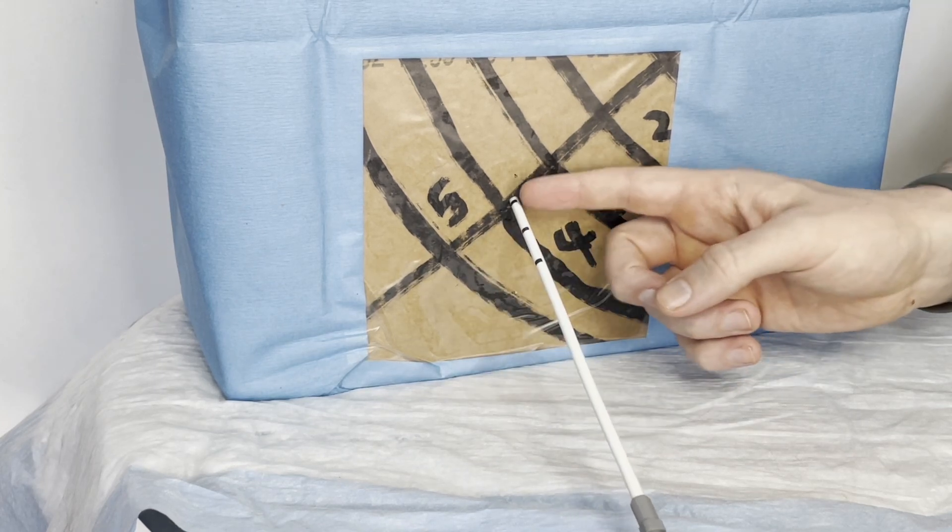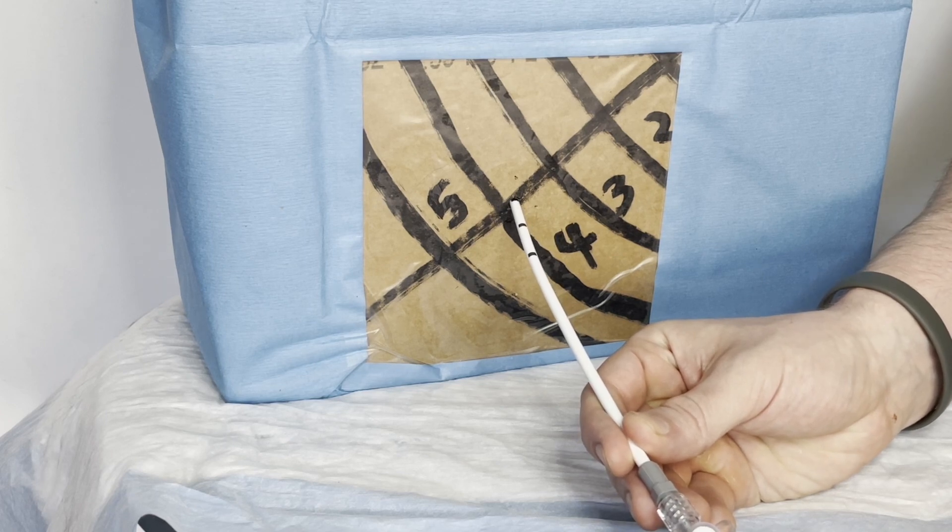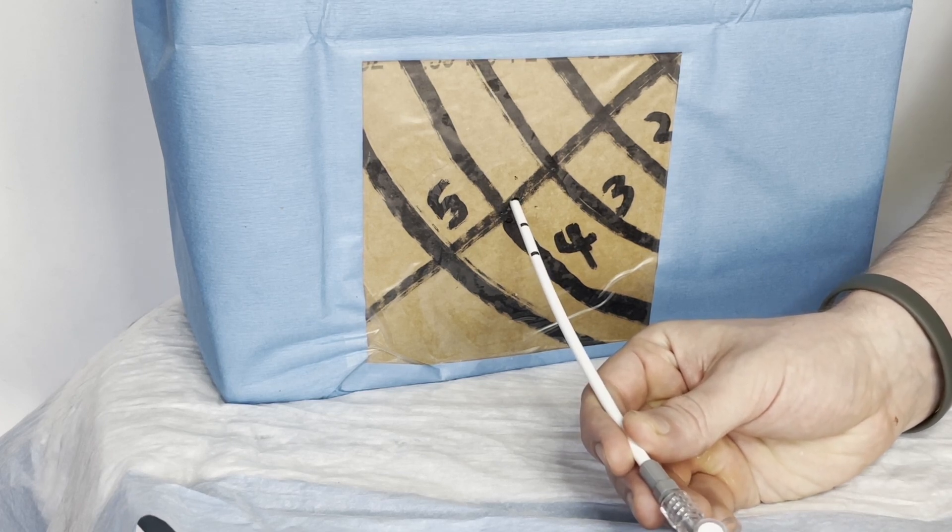And notice these black lines here. We're going to insert to one of these black lines. The patient isn't very big, so we're just going to insert to the first. That'll give us plenty of space.